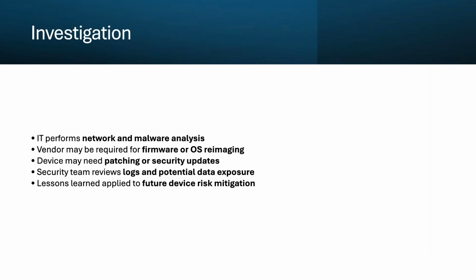Finally, we apply lessons learned to future device risk mitigation. Every incident teaches us something. We use these insights to strengthen our security posture, update policies, improve monitoring, and prevent similar incidents across our entire device fleet. This continuous improvement approach is essential to staying ahead of evolving threats.